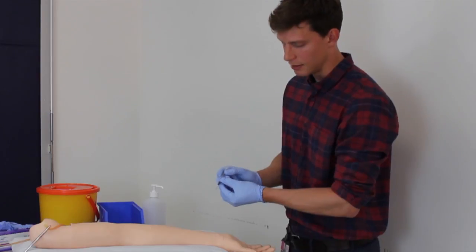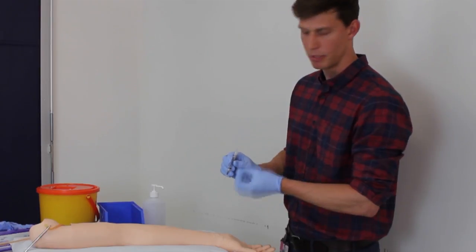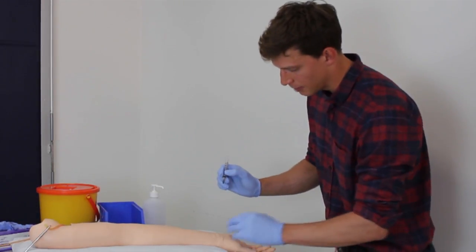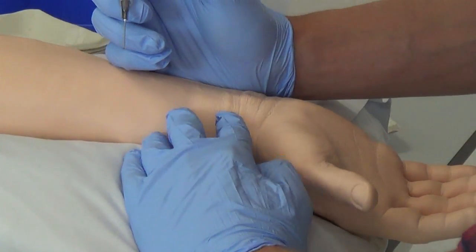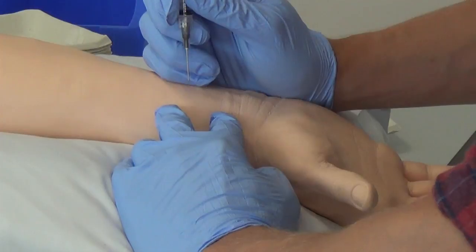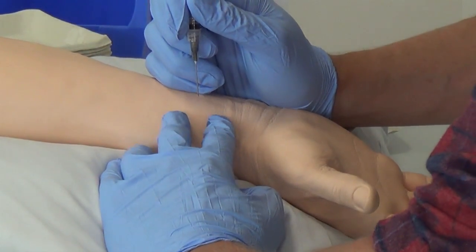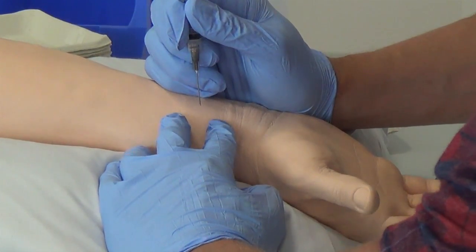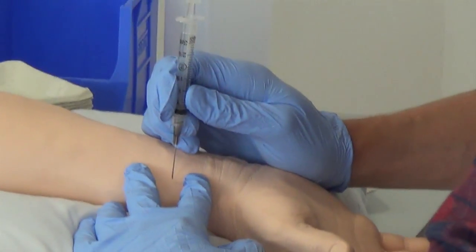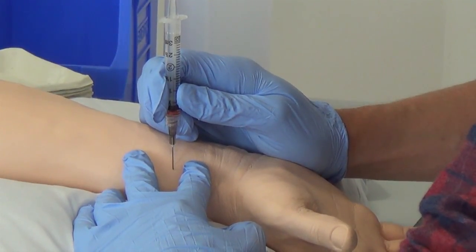I'm going to place the needle at 90 degrees into the radial artery, and the pressure of the artery pushes blood into the syringe without me having to pull on the plunger. Now that the alcohol is dry, I re-palpate, aim between my fingers to visualize where the artery is going, warn the patient there's a sharp scratch coming, and place the syringe at 90 degrees. You can see the blood pushes the plunger up.